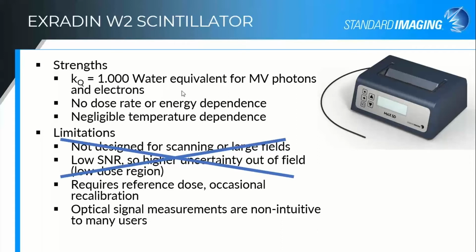And for measuring the output correction factor for the W2, I had the equations back there on the other screen. Sorry about that. It's also delineated in the user manual if you wanted to do it on your own, but really you would measure the maximum fiber configuration, the minimum fiber configuration. The system will calculate a Cherenkov light ratio, or you can do it on your own in Excel if you want to double check it.